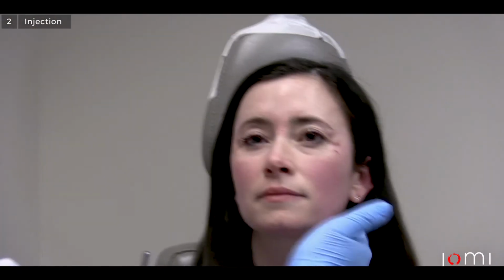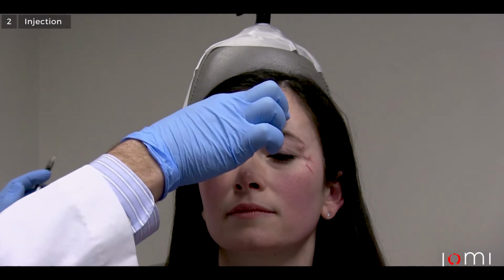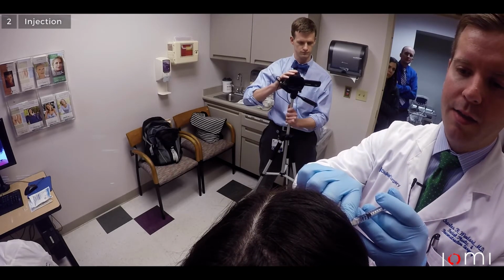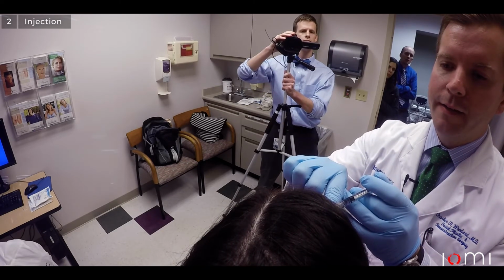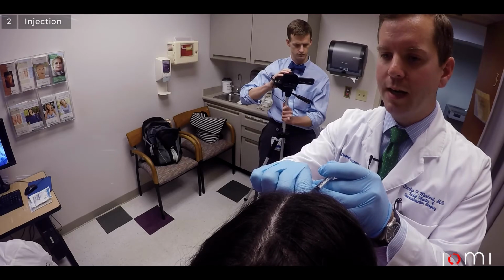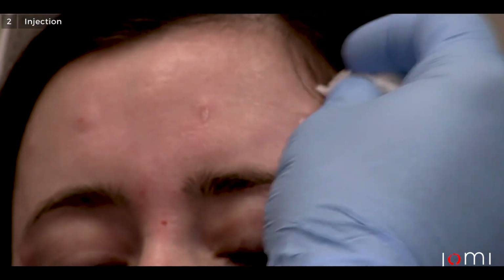And then just a touch in her forehead, and what we're doing that for is to counteract. We've taken away a lot of depressor function, so the frontalis is potentially going to be overactive and potentially peak her brow up a bit, so we're just going to relieve that by putting a small amount in her forehead. I think it would be adequate to put 5 units on each side and we'll be done. I'll do that in 2 injections of 2.5 units each. You notice that I'll use my contralateral hand to steady the injection site. And watch out for any underlying veins.